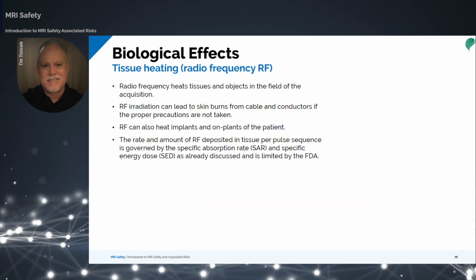The last biological effect to look at is tissue heating. As we studied earlier, as part of the safety concerns of radiofrequency, RF heats tissue and objects in the field of the acquisition. The heating of tissue is nevertheless a biological effect.